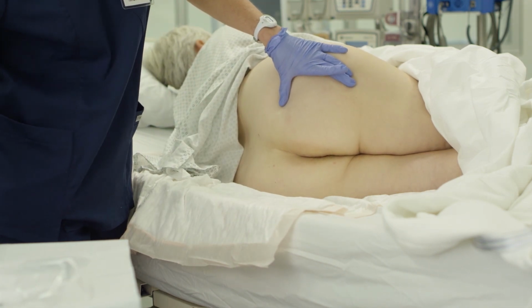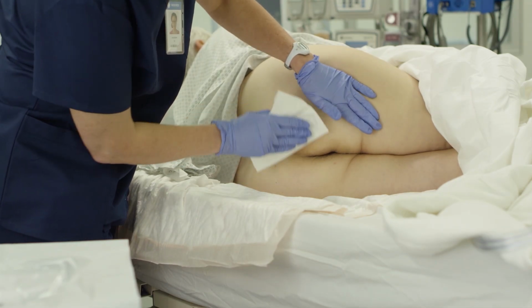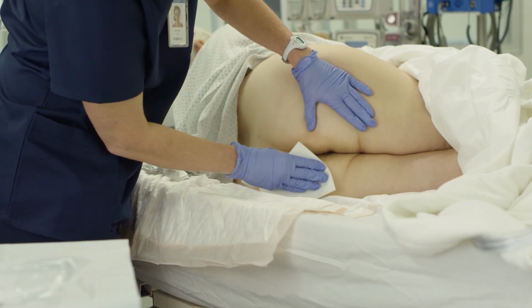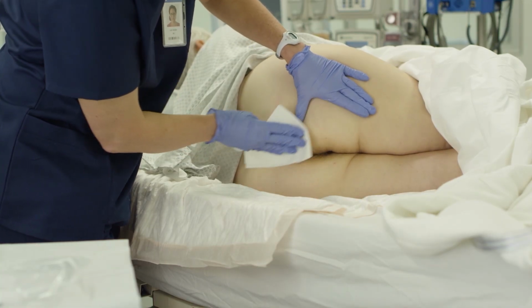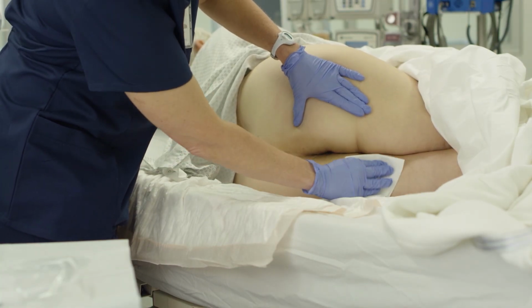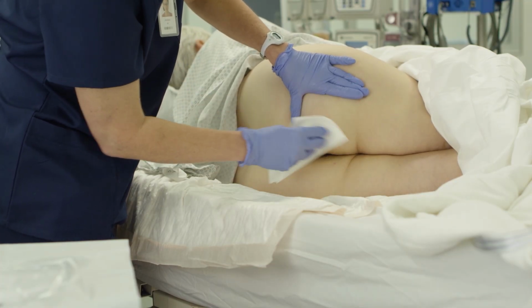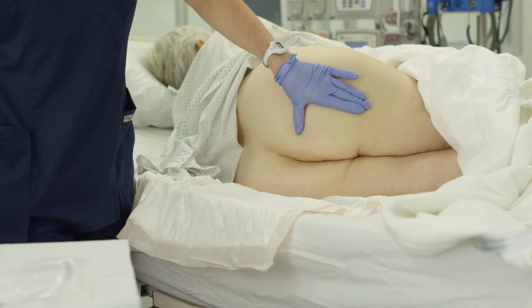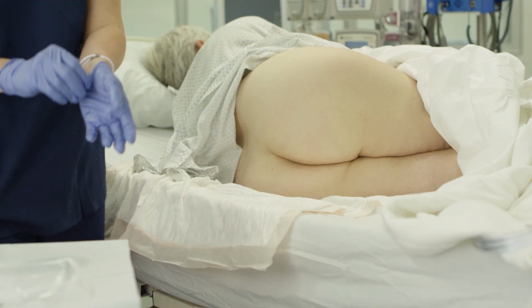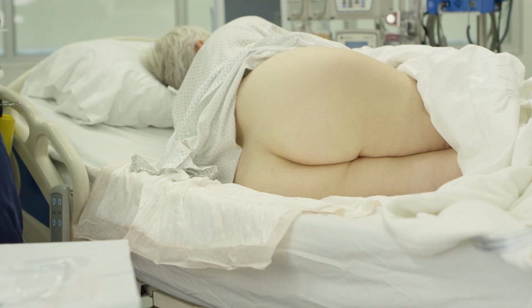If this is the first time 3M Cavilon Advanced Skin Protectant is applied, you'll need to remove all previously applied barrier ointment or paste from the skin. Gently dry areas of intact skin if needed. Again, if the affected area is severely damaged and the skin surface is quite wet, you can gently blot excess moisture with a dry, soft, non-linting cloth or a gauze pad if necessary.